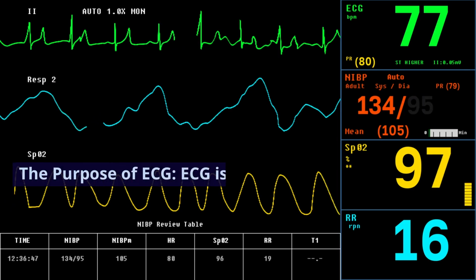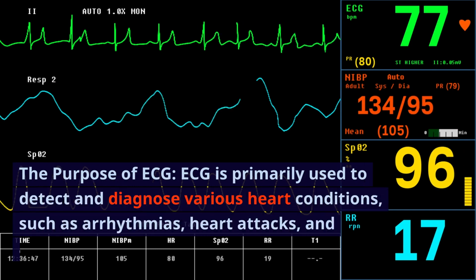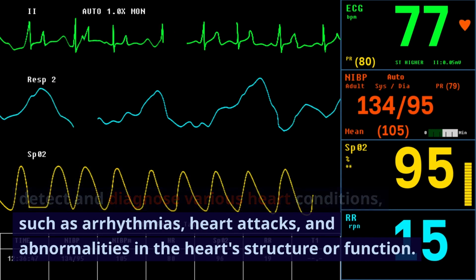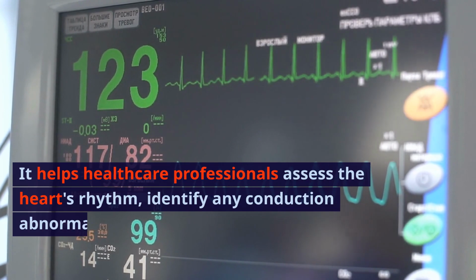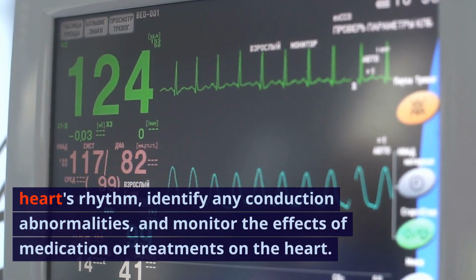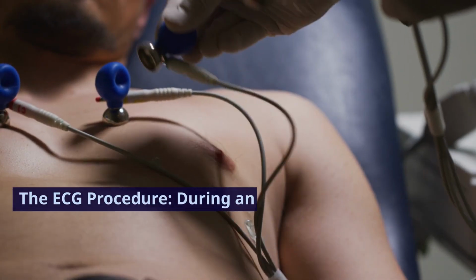The purpose of ECG. ECG is primarily used to detect and diagnose various heart conditions, such as arrhythmias, heart attacks, and abnormalities in the heart structure or function. It helps healthcare professionals assess the heart's rhythm, identify any conduction abnormalities, and monitor the effects of medication or treatments on the heart.